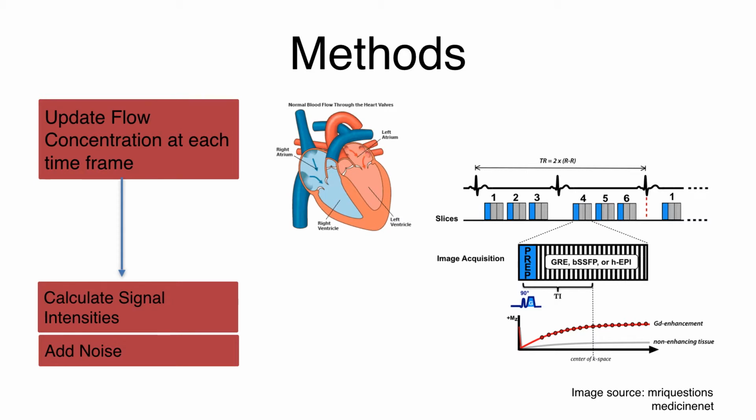For acquisition of signal intensity for first pass perfusion, there are two steps. First is the preparation of the magnetization, which involves a saturation recovery, which involves a 90-degree non-selective pulse application, and then there is a crusher gradient. After the application of the crusher gradient, magnetization recovers based on the T1 value. As the contrast agent shortens the T1 value, it recovers faster.